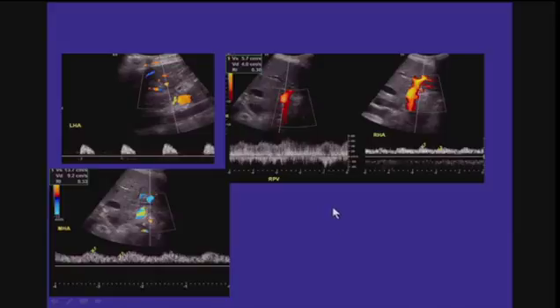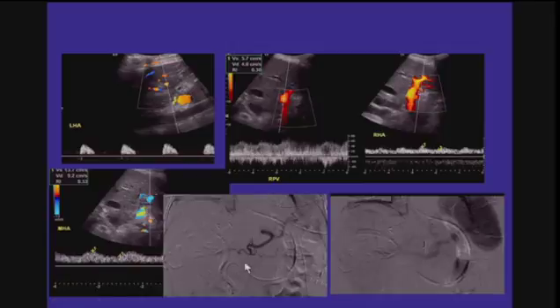So this patient went on to angiography, in part because I think originally we may have suspected that they had a hepatic artery stenosis or thrombosis. And when we inject, nothing goes really over into the right upper quadrant. Everything is going over to the spleen. You can see here the spleen is filled out. You can see big splenic vein. Again, not much happening over here.